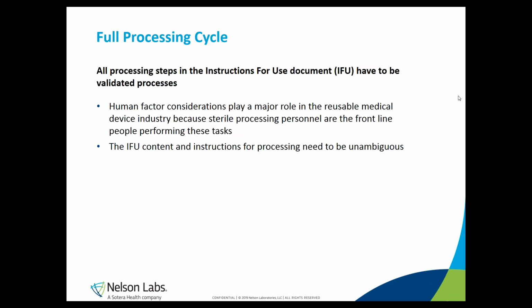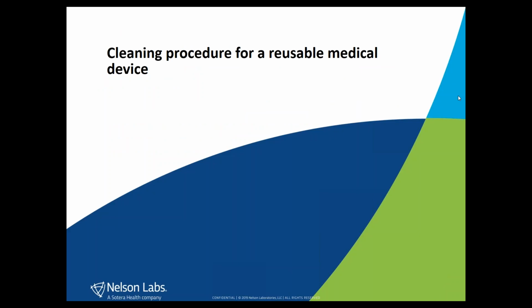It is simply not allowed to put unvalidated processing steps into the IFU. So, now we are going into more detail about the validation of the cleaning, disinfection, and sterilization procedures for reusable medical devices.